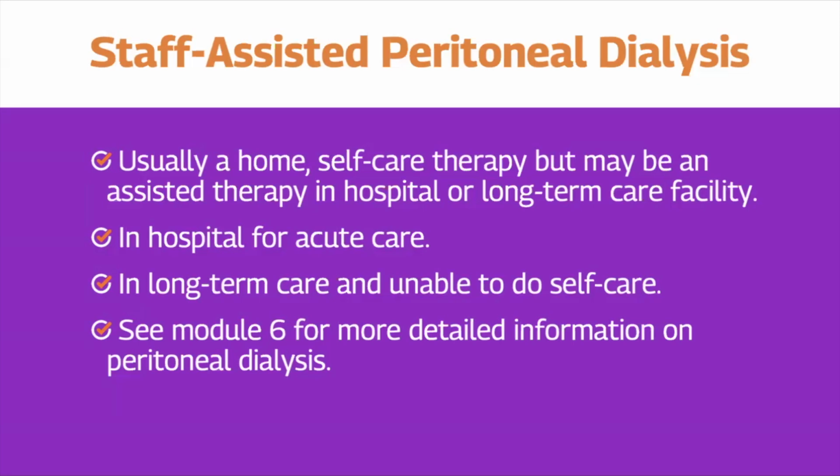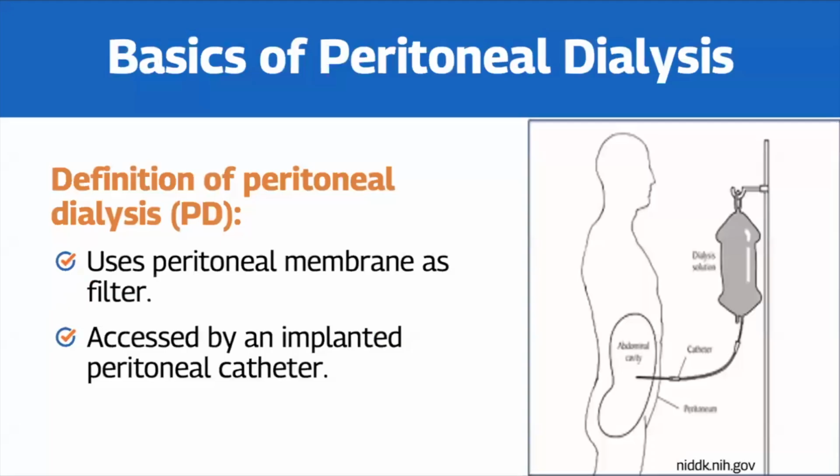There are also some patients receiving PD in long-term care who are unable to perform their own treatments. However, staff at those facilities are specially trained to assist the patient. More information on PD can be found in Module 6 of this series, which details home dialysis.